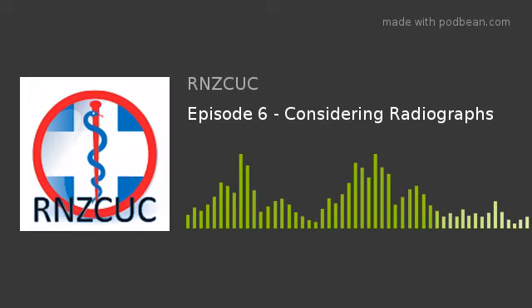If we're x-raying a finger, we generally don't get a patient to wear a full lead gown. The doses are a lot lower now than what they were back in the day when it was routine for everyone to wear lead all the time. If a patient requests to wear lead at any time, we definitely let them. It's their right if they want to have that extra protection. It may not be necessary, but they're welcome to wear it.